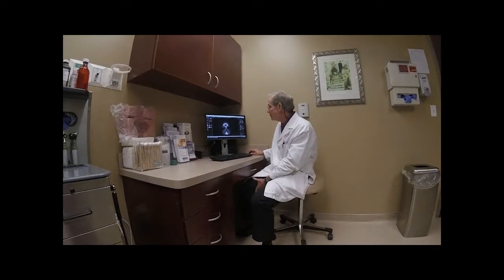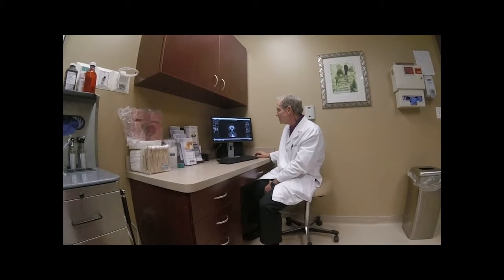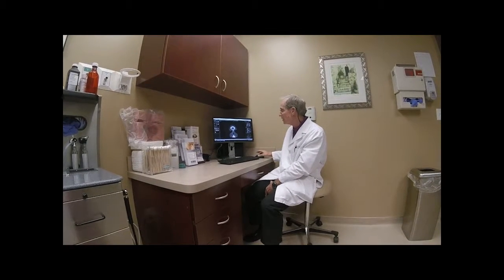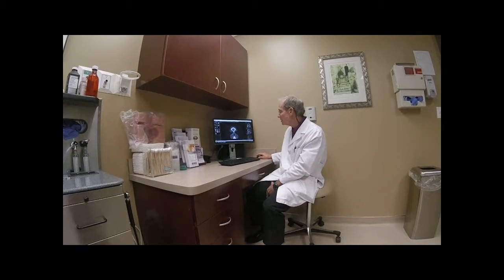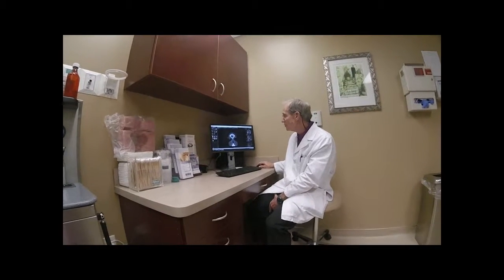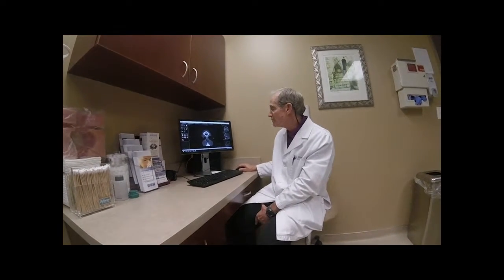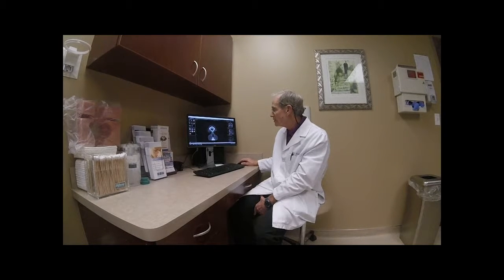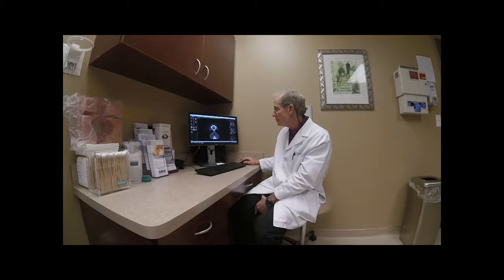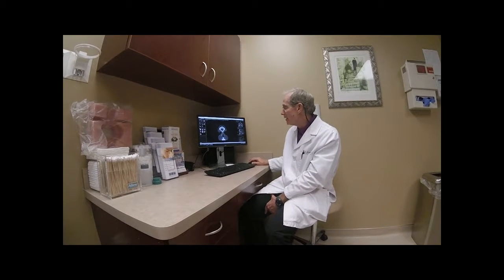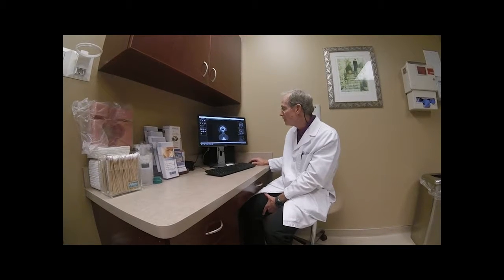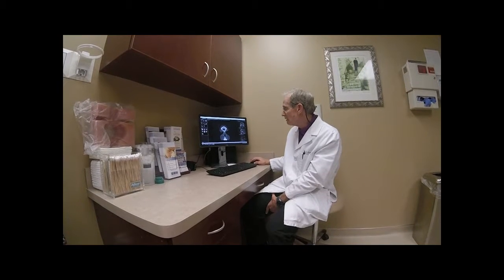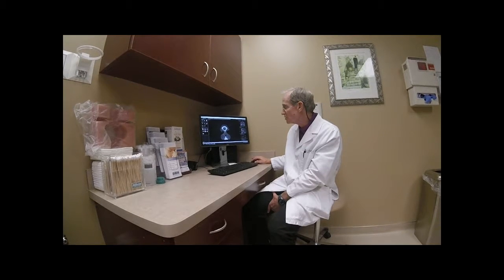As you look at this x-ray picture, the CT scan takes a series of x-rays in order, as if your head was a loaf of bread and we were going to slice it starting from front to back. We are near the front of the face here, and since the patient is looking out at us, the right side is on this side and the left side on this side. The eye sockets show up in this area, this would be the forehead, and this is inside the nose. On the x-ray, where we see dense white is usually bone, where we see black spaces means that's where air is, and lighter gray colors usually indicate soft tissue or cartilage.